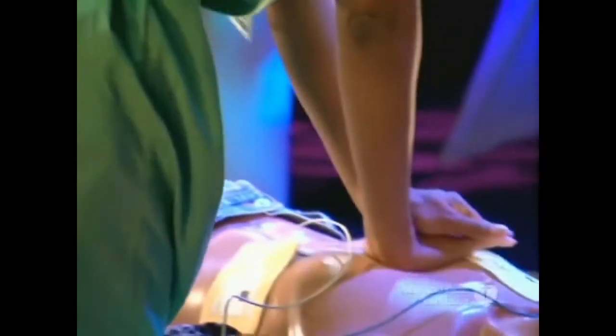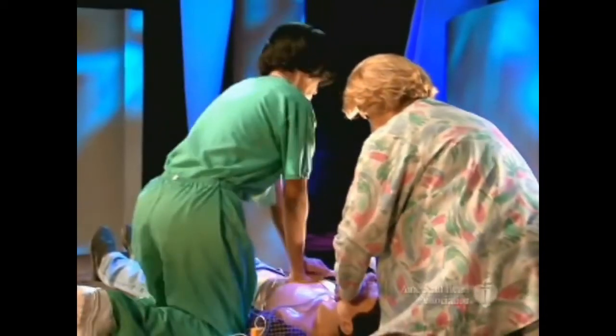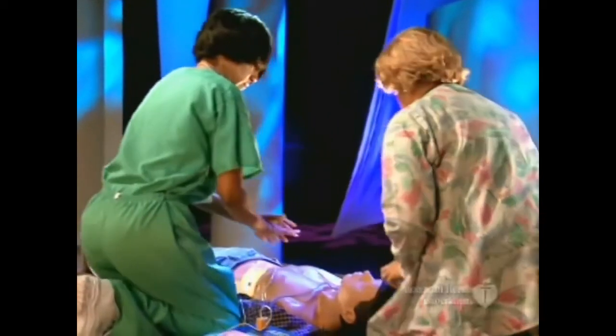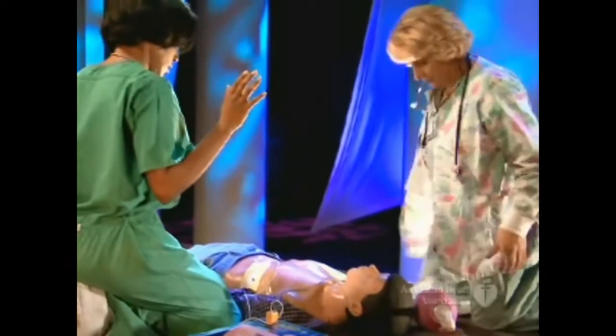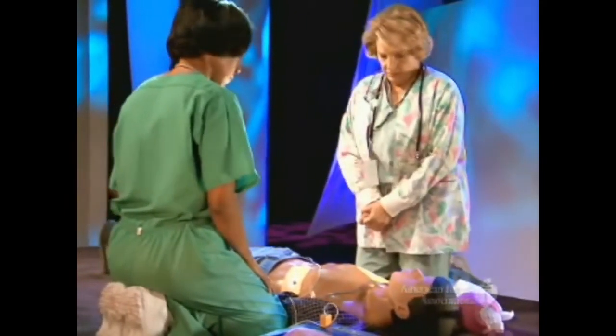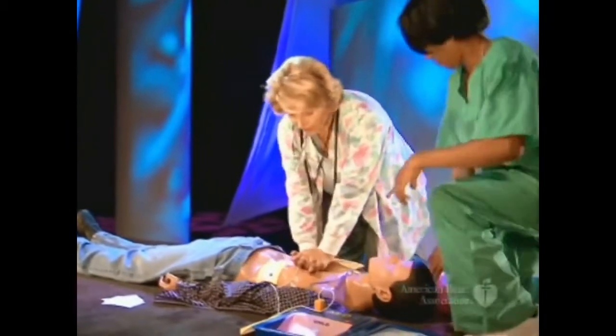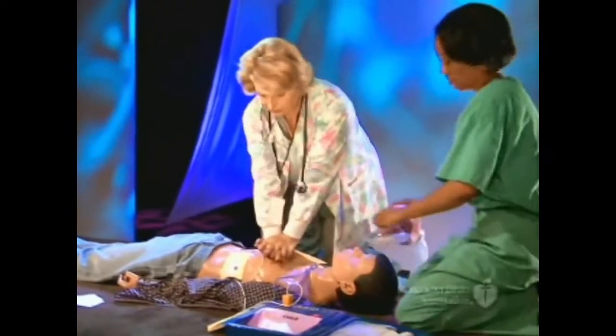The AED will then tell you to start CPR, beginning with chest compressions. Begin CPR. After five cycles of 30 compressions and two ventilations, pause for the AED to analyze. Analyzing heart rhythm. If indicated, press the shock button and switch rescuer roles. No shock advised. Begin CPR. Repeat this sequence of CPR and AED use until advanced life support providers take over or the victim starts to move.